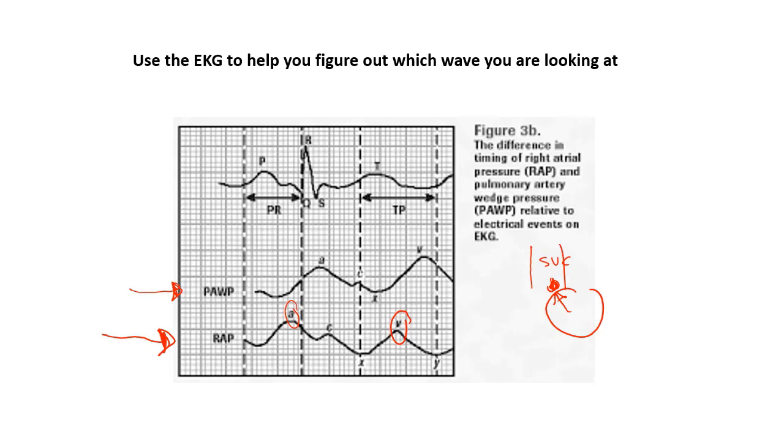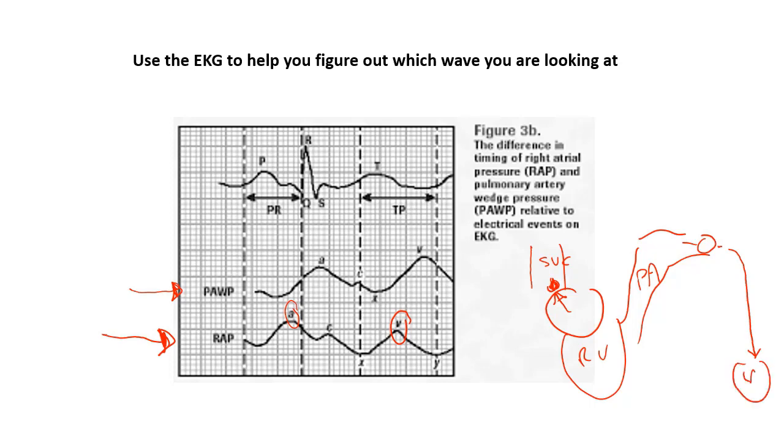When we've gone all the way up into our pulmonary artery and wedged out here, there's a long distance to get to the left atrium.